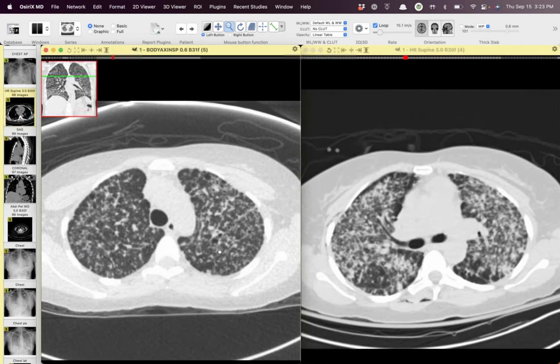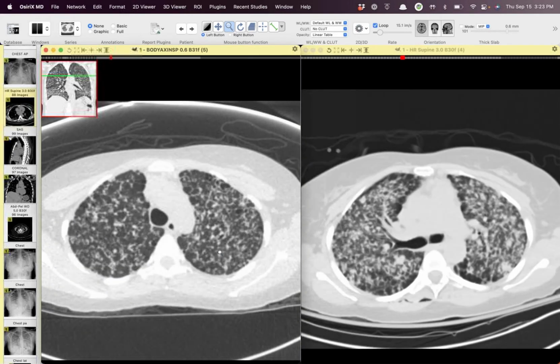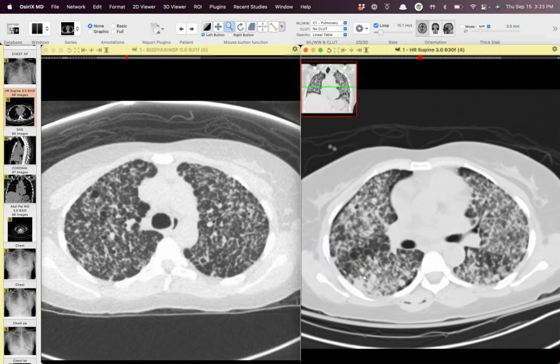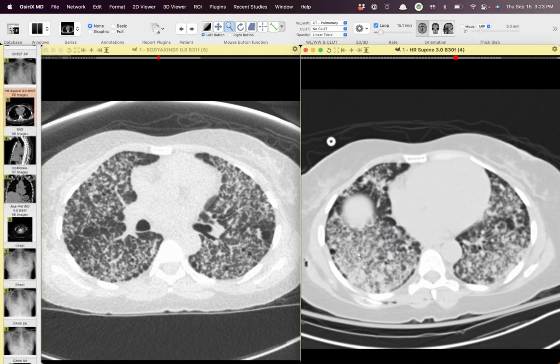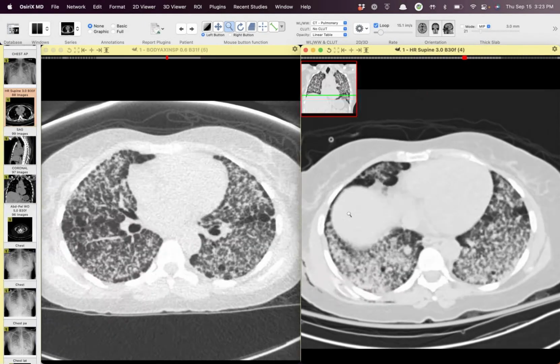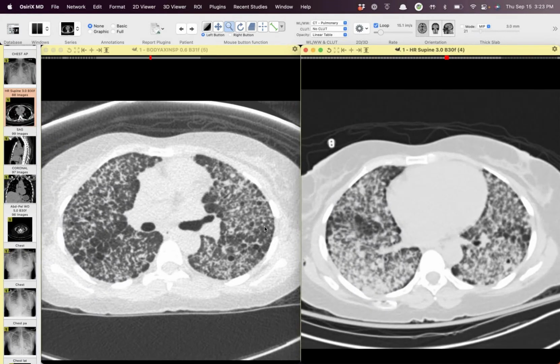Did they just shred the uterus and put it into her IVC? I mean, no idea. No idea. But it's interesting. I showed this to Sanjeev and Costa, and they had a case at Mallinckrodt not too dissimilar from this. Now, I have no idea if it's the same patient that happened to have gone to another institution too, but they had seen one that was this disseminated.